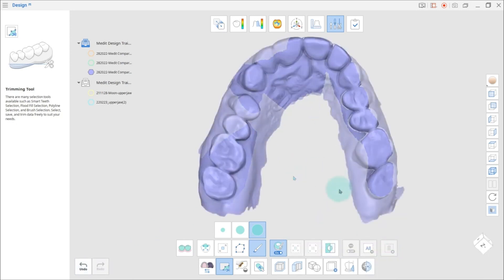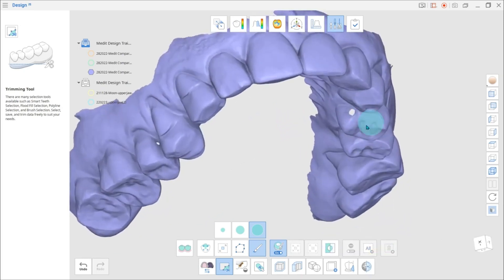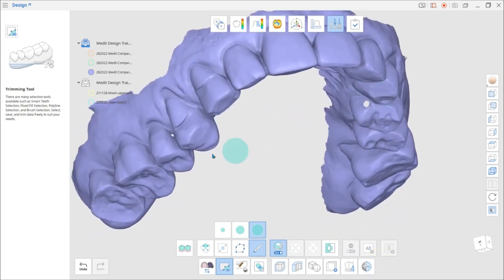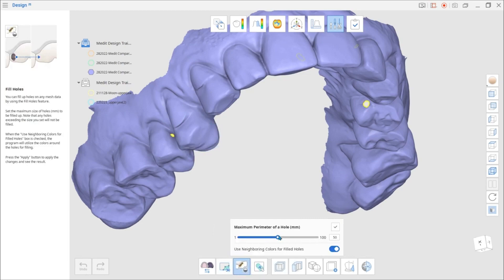If there are holes in your scan data, go to the Edit mode and fill them up using the Fill Holes tool at the bottom.